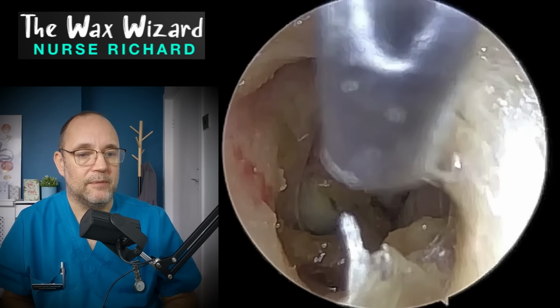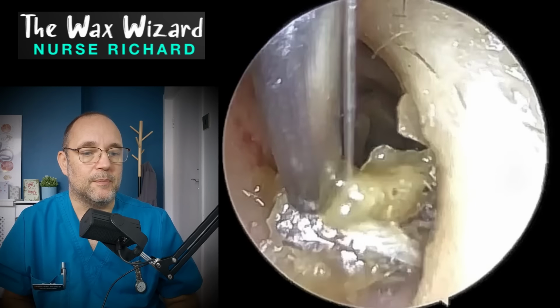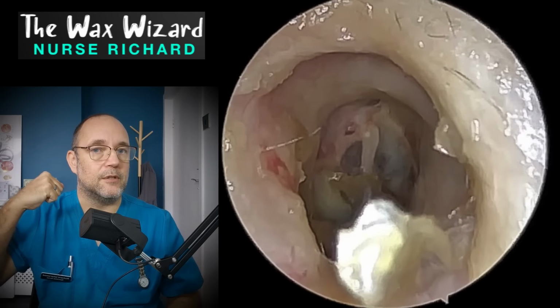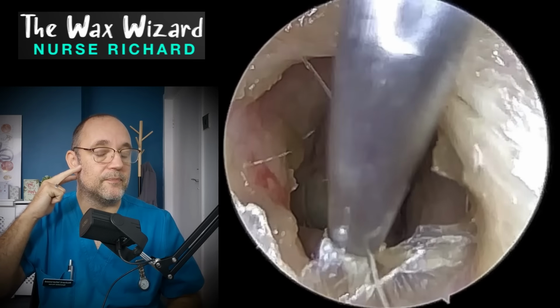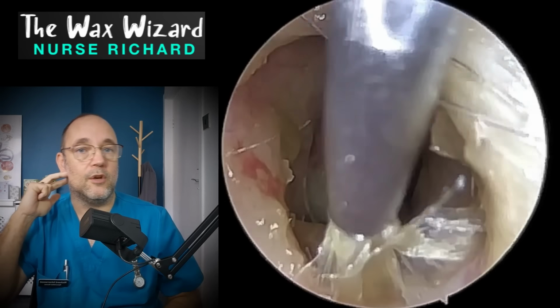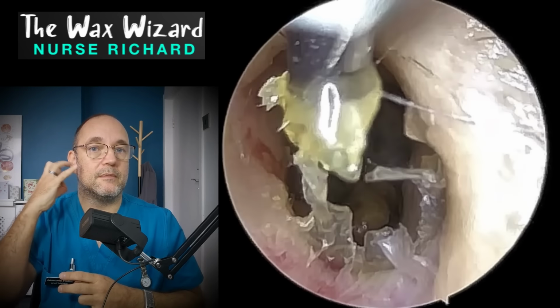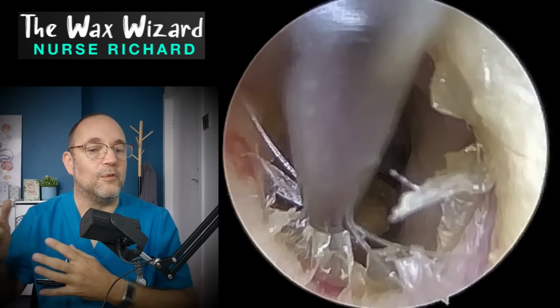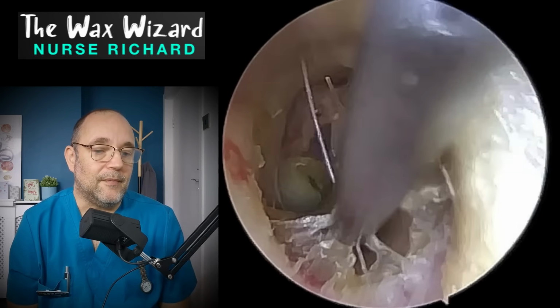Like I said before, she was coughing, moving, shaking, all things that make it particularly difficult with ones like this, but you have to work with what you've got, as long as you have a steady brace position. By brace position, I mean when you're holding the endoscope, I would hold it like that, and I would brace my fingers to the side, just underneath. So if the person does move towards you, the whole thing comes with you. And same thing when you've got the suction tool in. You would hold it like this, and you would usually brace a couple of your last fingers or your little finger there as well. So if that person moves, they would move with you. But if that person is very jiggly, things are going to start moving around a bit. It's kind of inevitable, really.